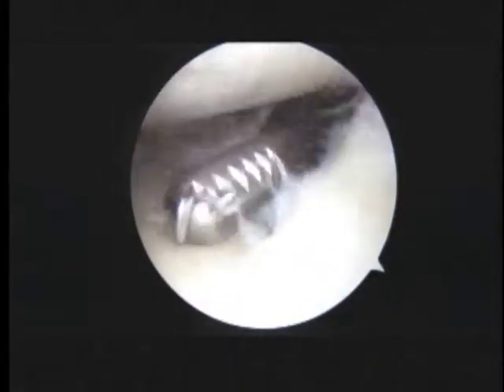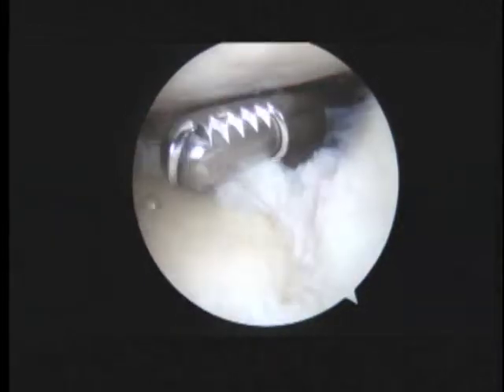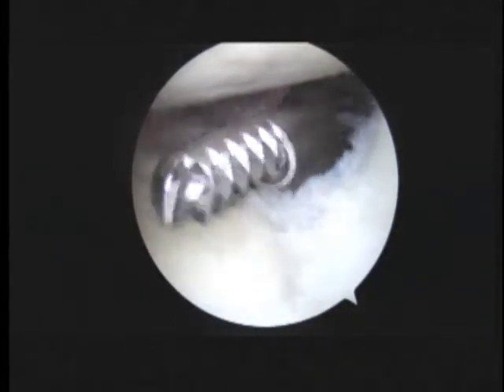Okay, so Dr. Buford, we're just getting started on the left shoulder. We've got a shaver in here just to help smooth some areas out so we can see a little bit better. We're going to be working on your biceps tendon to tenodese because of the tears that you have. Rotate up.